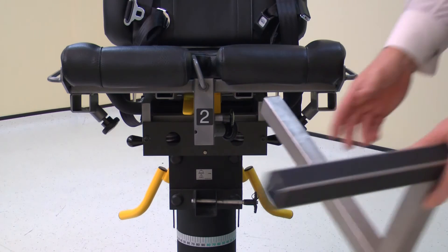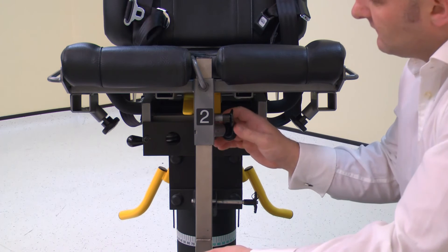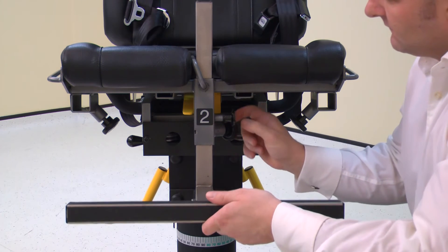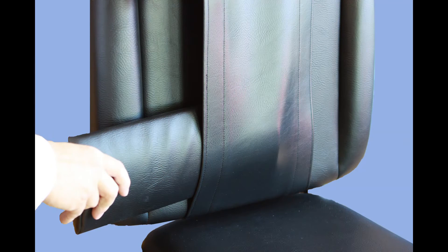Next, install the footrest into the chair using tube number 2. Pull the locking pin to allow full installation and secure with the locking screw. Place the lumbar cushion onto the chair if required.